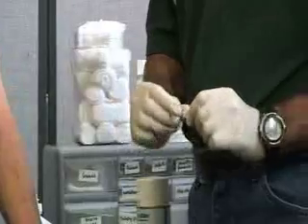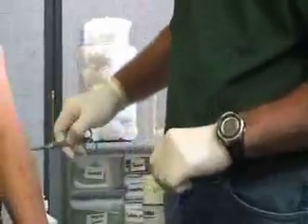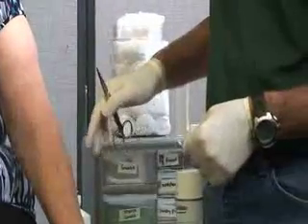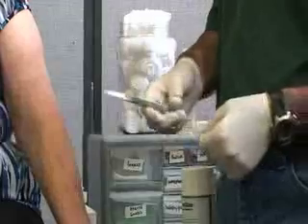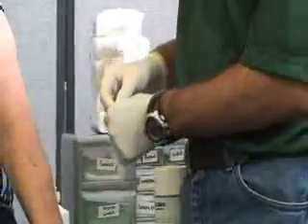For this one, we'll just take out the center parts. If we need a butterfly or Steri-Strip on a body part like an eyebrow or something, it's a pretty flat area and that's okay. But you can always shorten the strip if needed to fit that area.